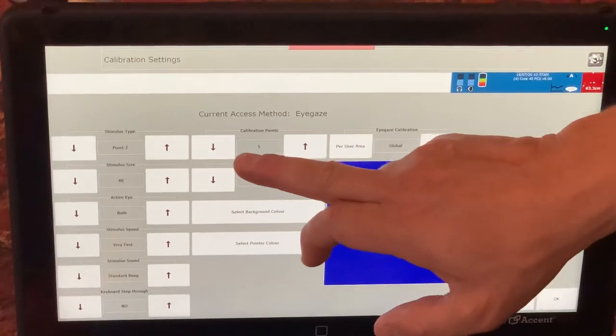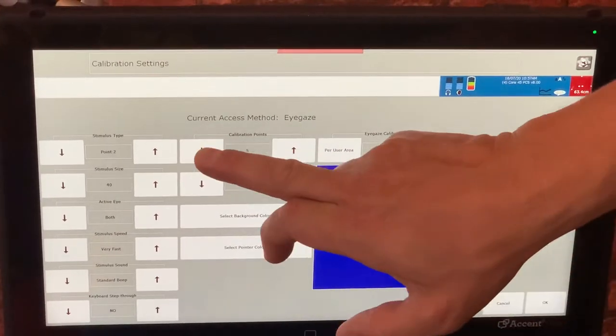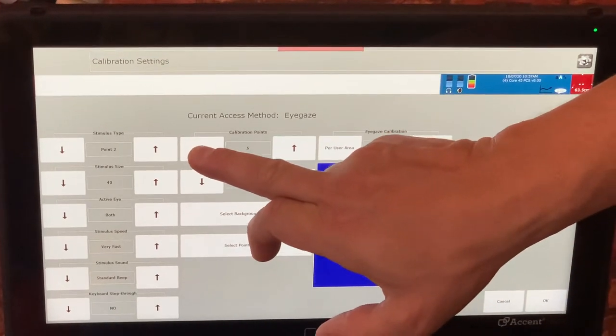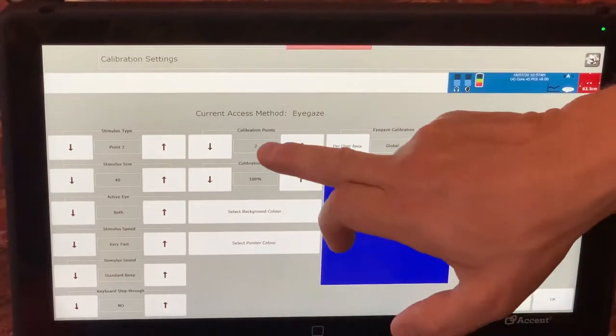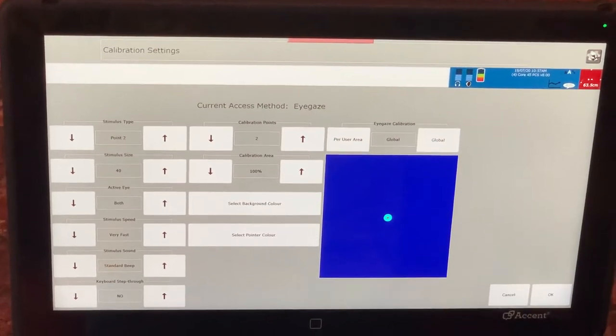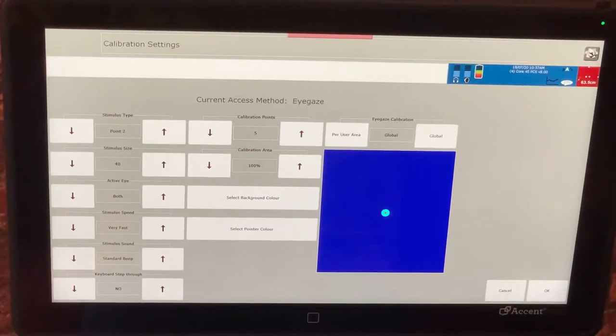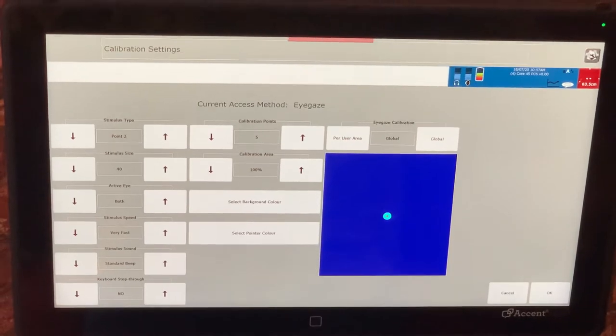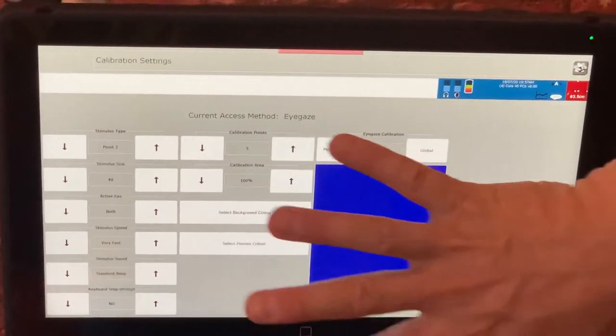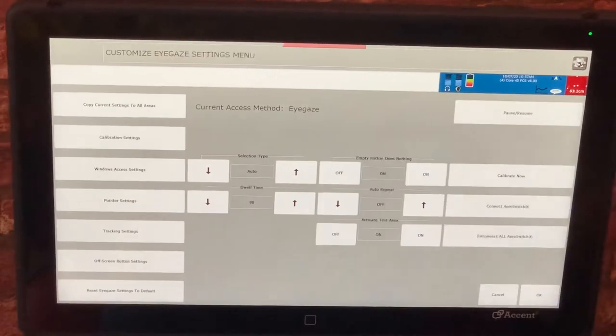If I want to make it fewer calibration points I can just press the arrow here and it takes it down to 2. Maybe you try that first and then take it to a calibration of 5 at a later step. So now I'm going to leave mine on 5 and I'm going to press OK.